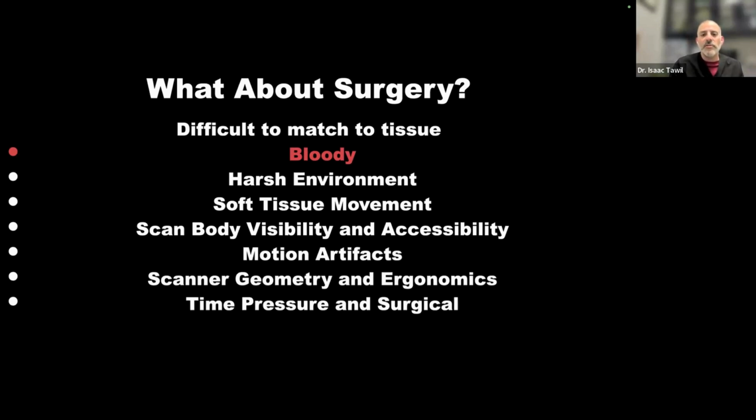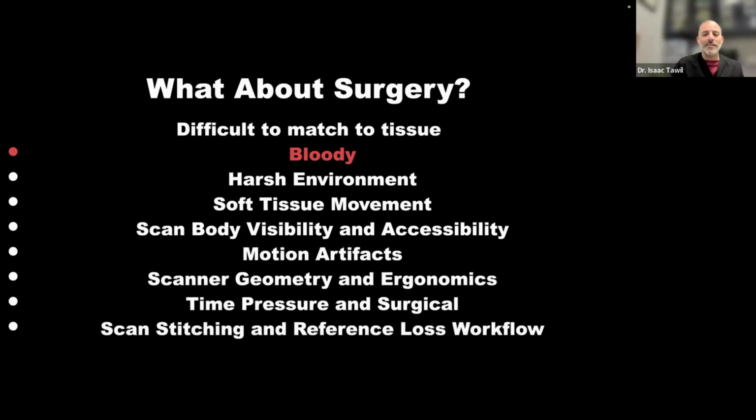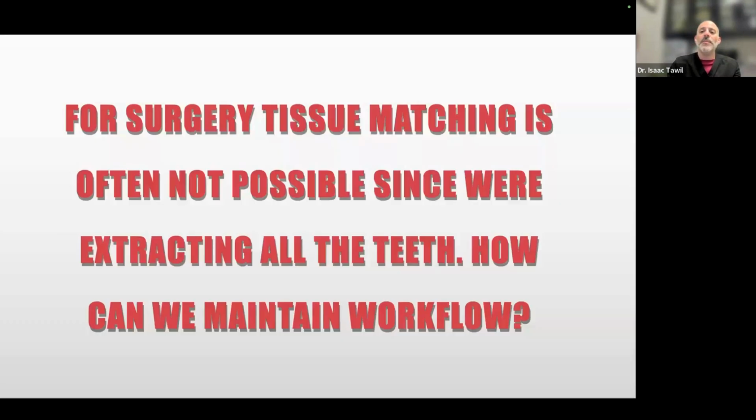Even just talking about it now stresses me out. Even though I love doing full arch, the thoughts of all these difficulties just make me uncomfortable. We also have to worry about the scanning and stitching errors. So for surgery, since matching is very difficult and often not possible, and since we're extracting all teeth, how can we maintain the workflow from the pre-op all the way to the post-op?